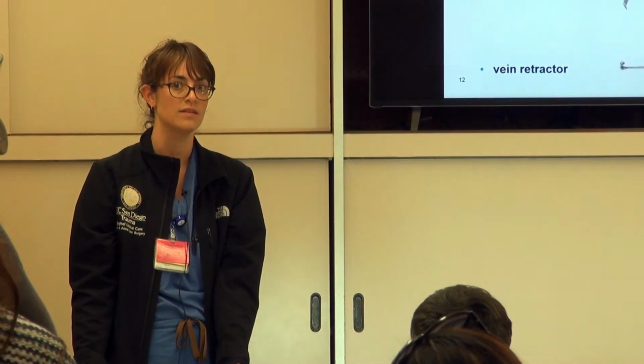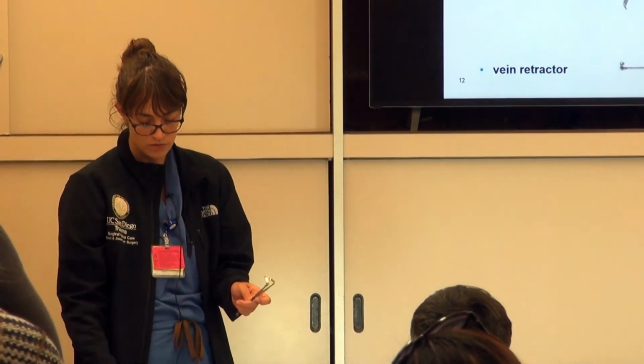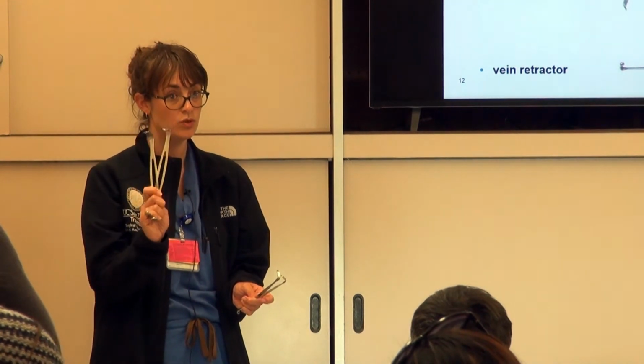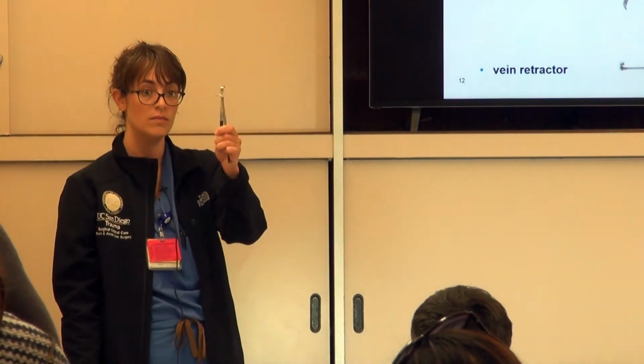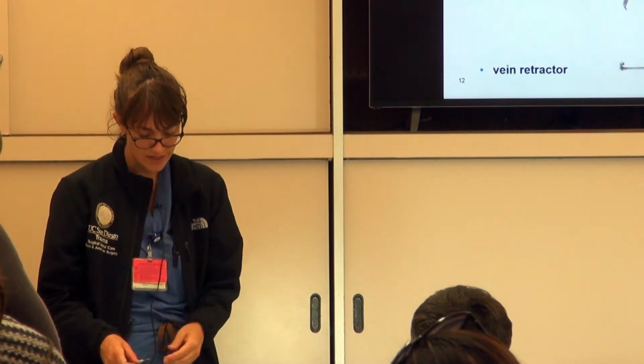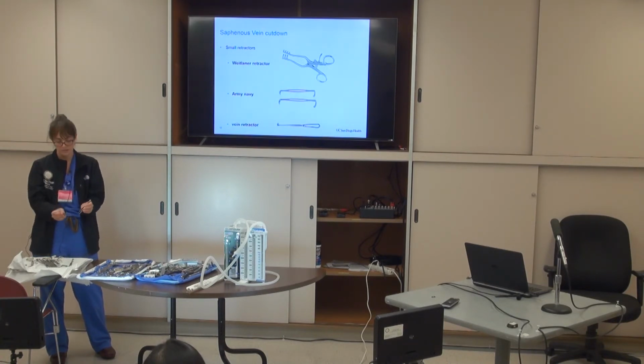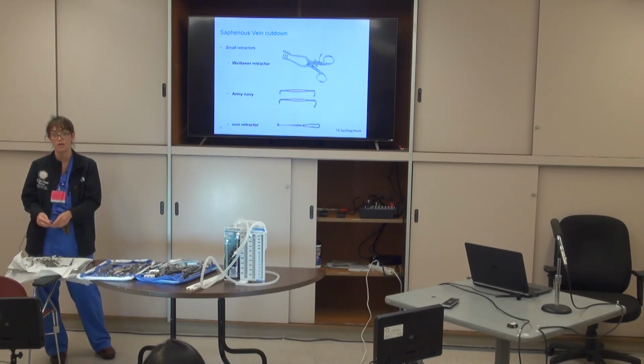Sometimes in central supply and cleaning, things don't make it back. If these are available, they're great. And sometimes just having a second set of hands helps. If someone else can throw on sterile gloves and use a forceps, the person doing the incision and dissection can use one, and the other can assist on the other side to help retract the tissue. That works just as well. You just need to know that it's okay to throw on some gloves and give a hand.